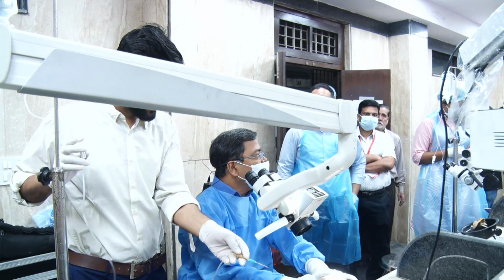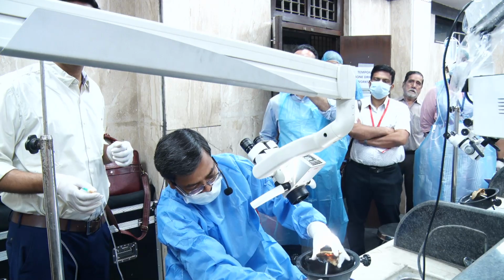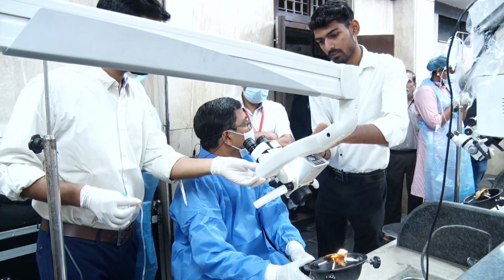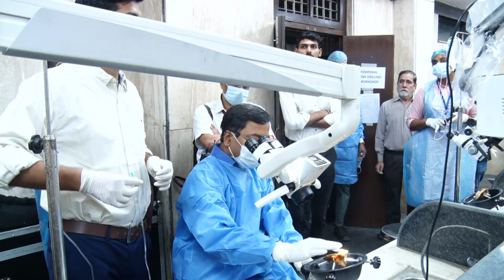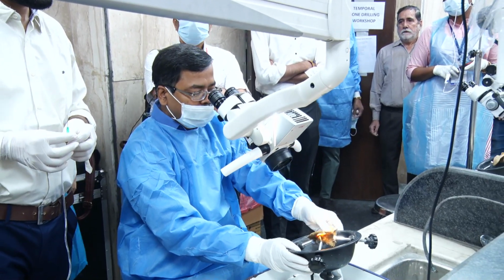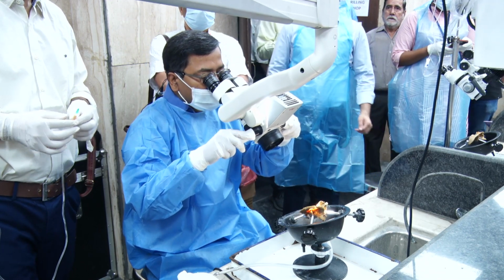Okay, so first of all, you have to hold the temporal bone in the temporal bone holder. It should be held in such a way that it simulates the actual patient lying on the OT table, right? So the zygomatic arch should be facing anteriorly, and the squamous part of the temporal bone should be facing superiorly, and the mastoid part should be facing inferiorly, right? So that is how you actually hold the temporal bone. And I am sure you all know about focusing the microscope.